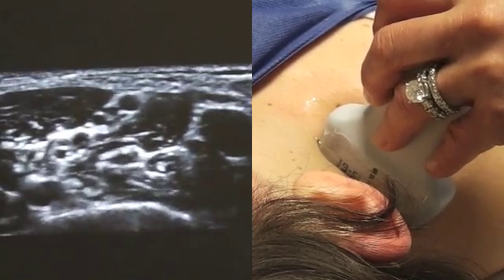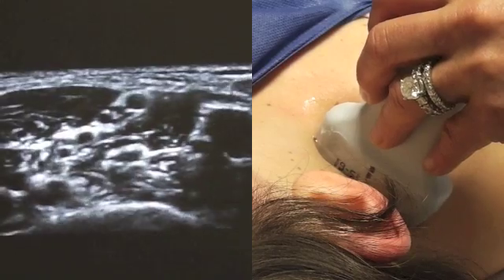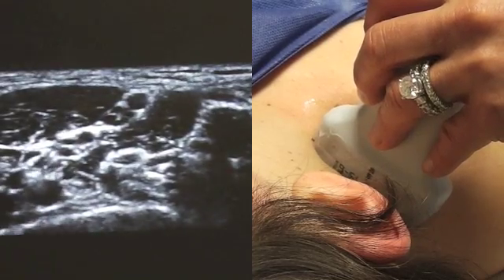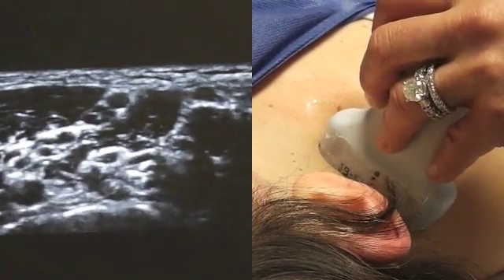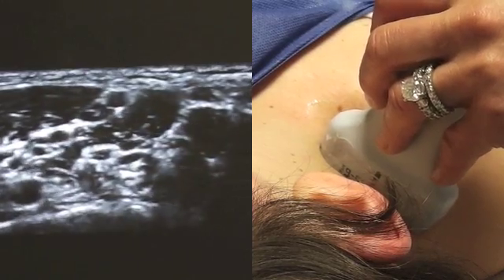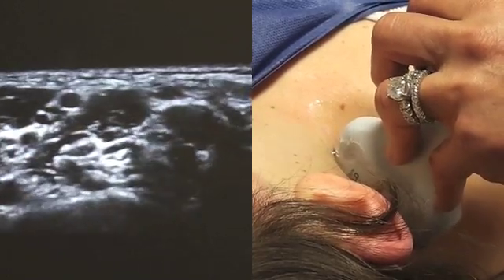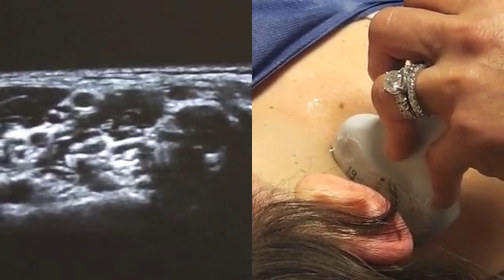You can see the plexus is very superficial — only about a half a centimeter to a centimeter below the level of the skin. For this block, I'm going to use a 50 millimeter 21-gauge needle because I do not need a long needle given how superficial the plexus is. The needle approach is going to be very shallow, hugging the ultrasound probe. You're not going to have to go very deep at all.